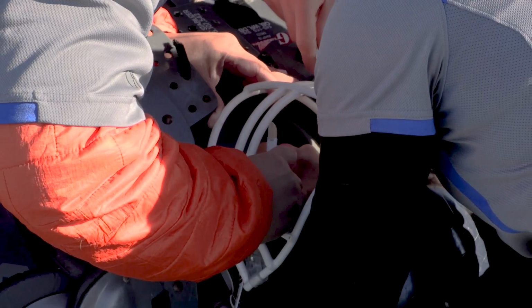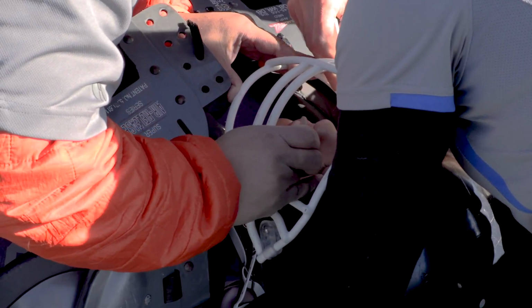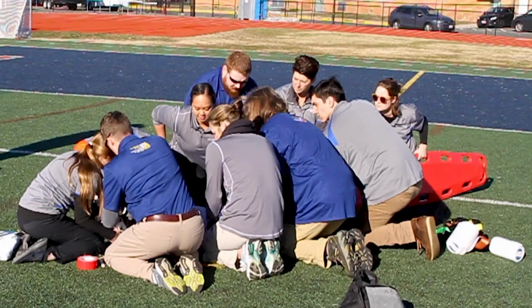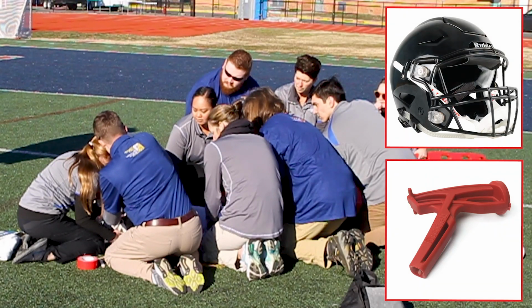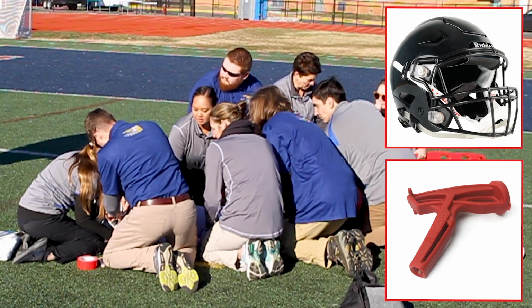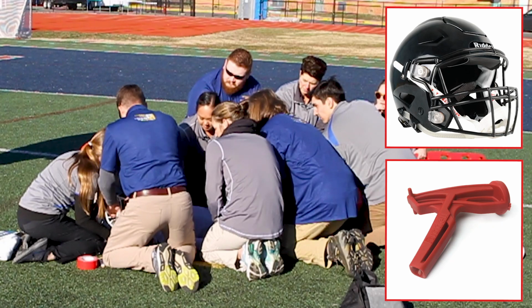Depending on the type of helmet, the cheek pads need to be released from inside the helmet using a tool with leverage. Tongue depressors taped 2 to 3 thicknesses can be used to twist at the snaps. Some helmets have quick-release face masks that allow quick and easy access to the face and airway. The lead needs to provide counter-pressure to the movements occurring as the cheek pads are released and removed.